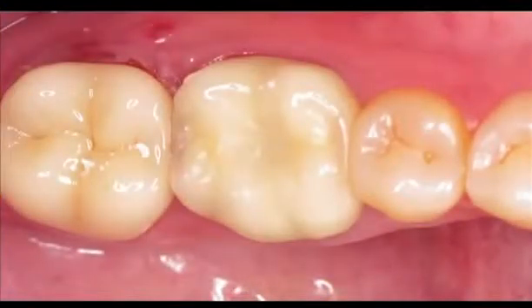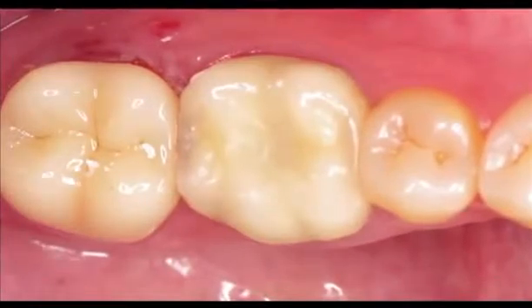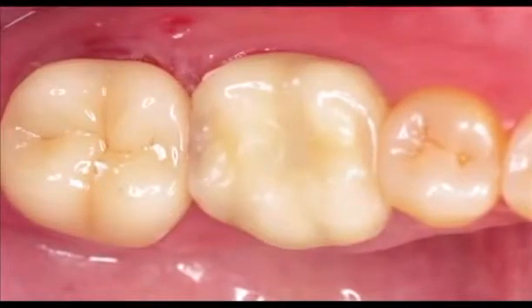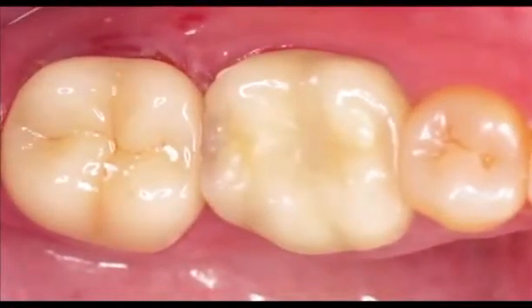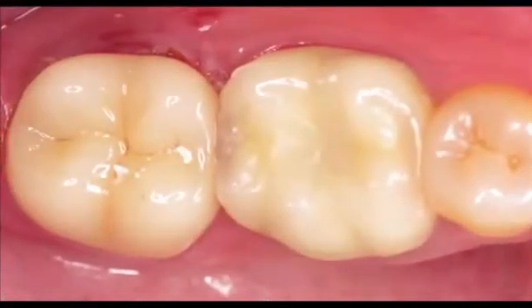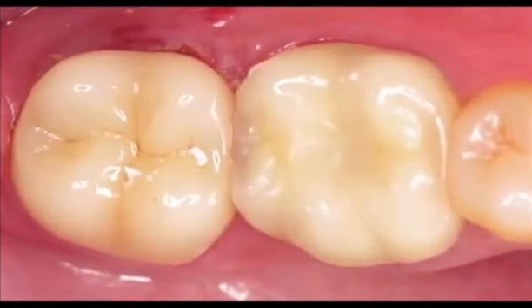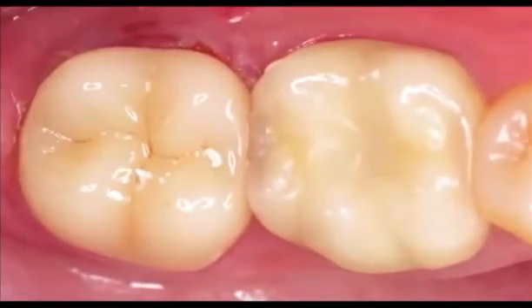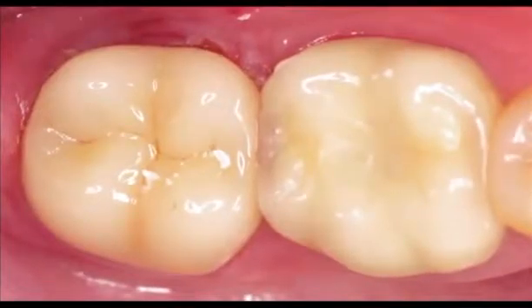After milling, we would fire it, of course. This is Emax, which takes about 15 minutes. It'll finalize the crystallization, and then we cement this. Now, I chose to cement this with a resin-modified glass ionomer, Fuji Plus, because I didn't feel comfortable about keeping a dry field down there in such a deep zone subgingivally. But because it had good mechanical resistance and retention form, we can use resin-modified glass ionomer with Emax routinely.